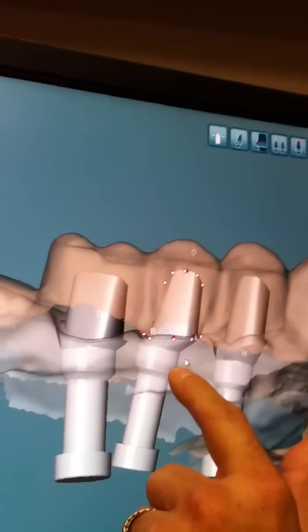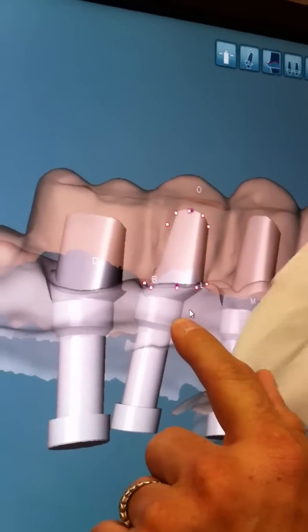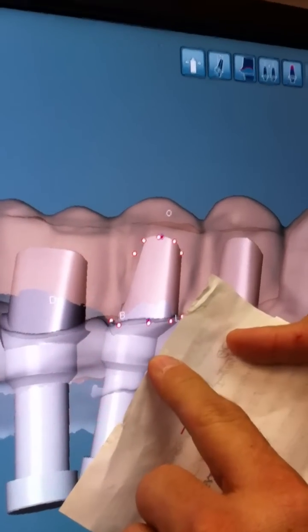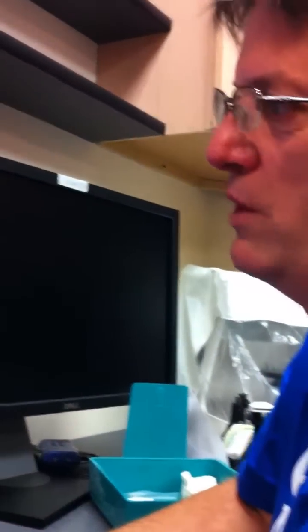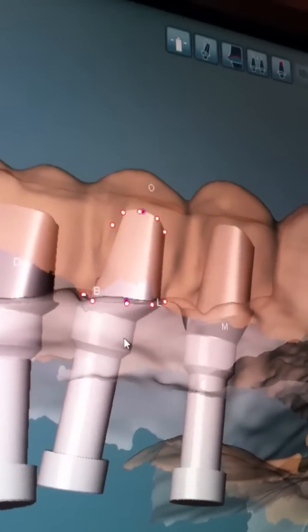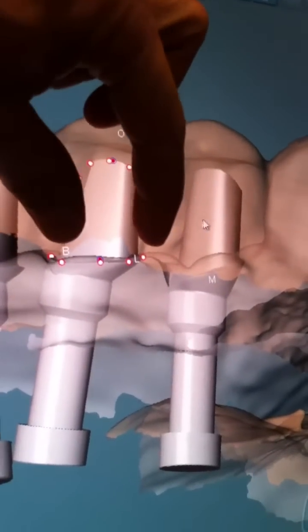So if we had an implant that was deeper, you would have a shallower angle, and that angle is where I have a problem because we're pushing tissue fairly hard, and once again, hard to clean. If cement gets under the steep angle, how are you going to get it out of there? Exactly. Very difficult.